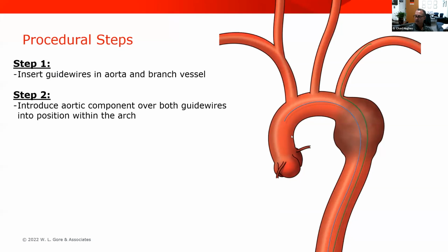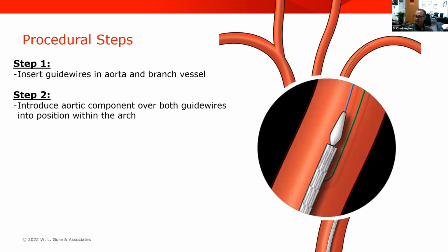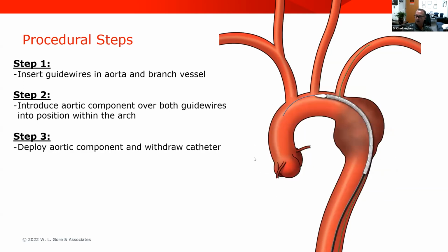And then this is just quickly how the device works. Generally, you get aortic access like you normally would, and then a second wire is passed up from the same access in the groin out to the target vessel. The device has a main center hole where the main heavy wire goes in. There's a side portal that has a special way you feed it through that orients the portal to the outer curve. The aortic components then pass up.